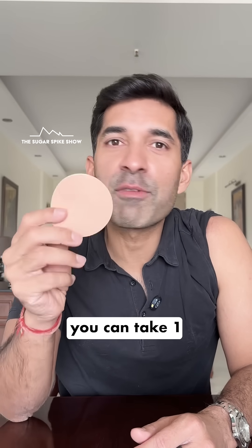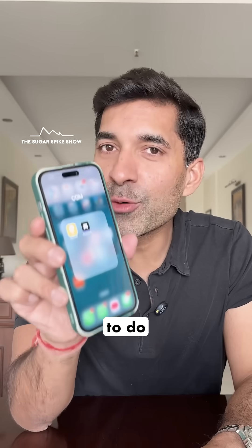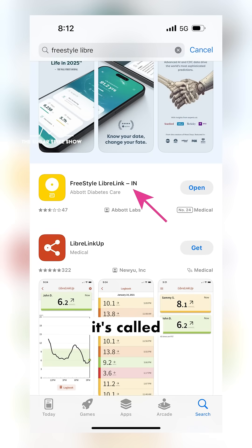To protect your sensor, you can take one of these patches and paste it on top. And now all you have to do is download the free app by Abbott — it's called LibreLink.